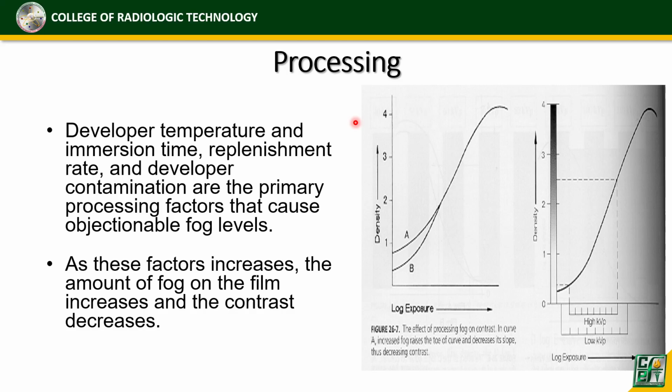Kung ano ba, okay na ba yung image? Underexposed pa ba? So sausaw uli. Tapos check uli. Okay? So may maraming chance to develop or to acquire good quality radiograph kapag manual. Siyempre, kailangan pa rin ng use of proper technical factors.